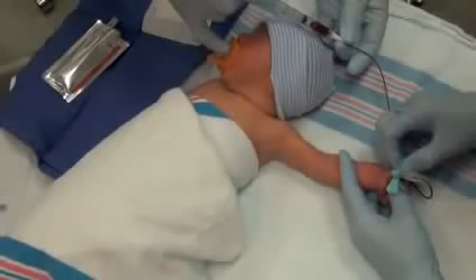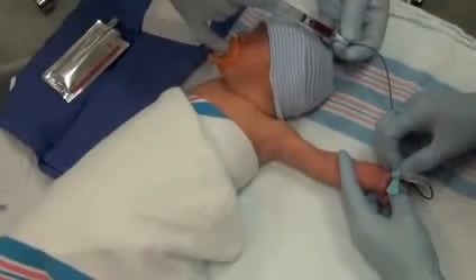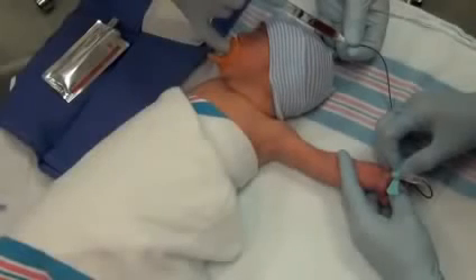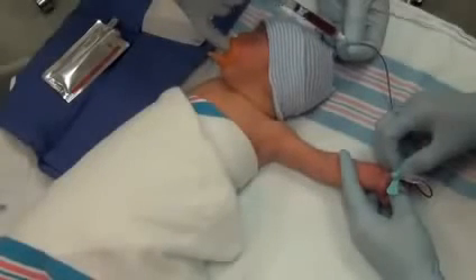The infant's identity was assessed by utilizing two of the approved JACO identifiers and blood collection necessity was confirmed with the medical provider. In addition, oral sucrose was administered two minutes prior to initiating this video recording and administered intermittently for continuous pain control during this minor procedure.